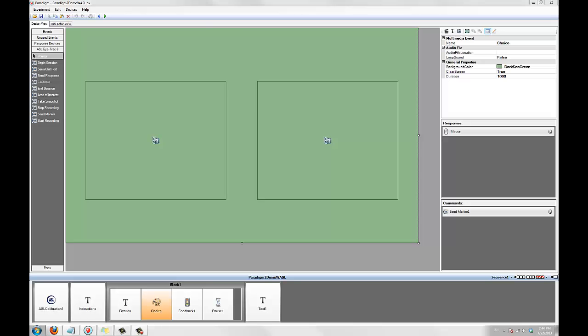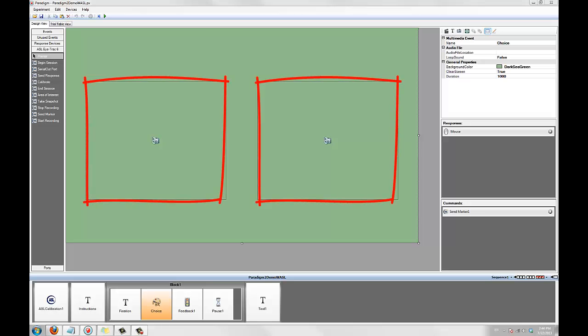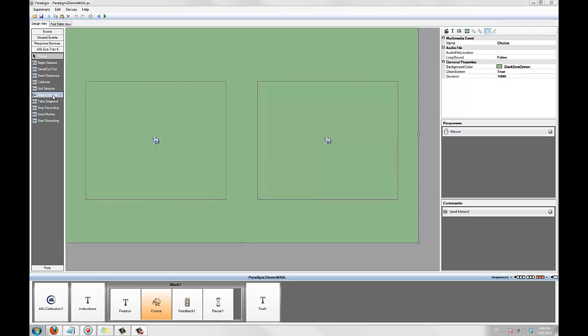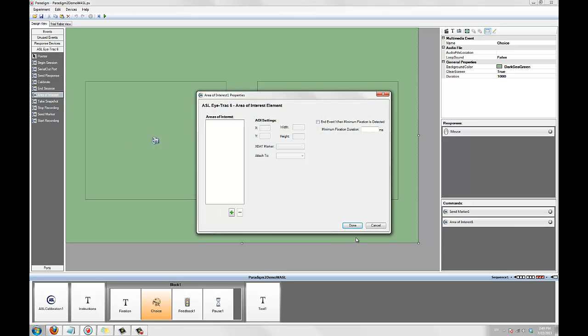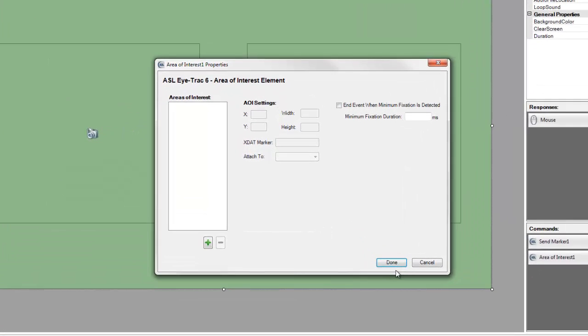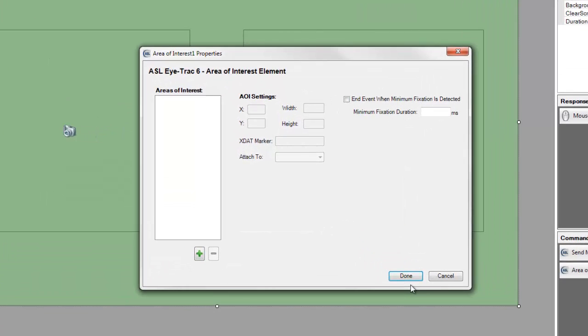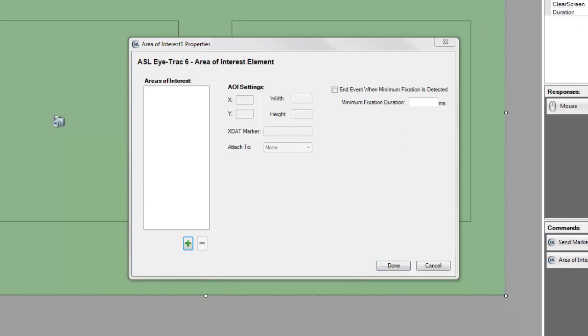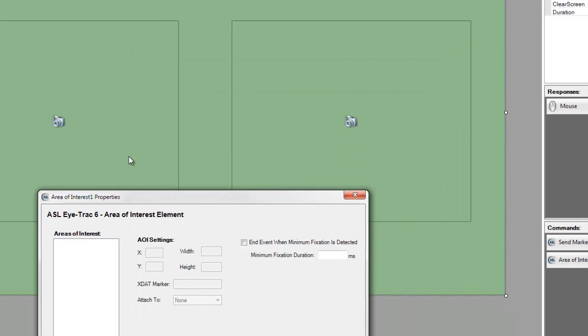Next, we'll use the area of interest element to mark fixations on the two images that are presented by the choice event. I'll drag the area of interest element into the commands area, and a serious looking dialog box will pop up. This is where we'll define the location and size of each AOI. We'll also be able to specify an XDAT for each AOI that will be sent when Paradigm detects a fixation. You can also specify a minimum fixation that will end the event. I'll add two AOIs, one for each image, and assign a unique XDAT to each one.